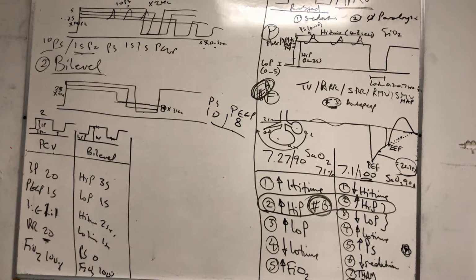Nobody's complaining about it. When we started doing 2 SBTs a day, what happened is that now the respiratory therapist is in CAT scan, for example. So the nurse turns off the sedation and then calls for the respiratory therapist. He comes in 15, 20 minutes later, half an hour, 1 hour later to switch the patient to pressure support, and we started seeing problems. The nurse is saying the patient is not even tolerating the SAT. Not the SBT. We didn't even put him on the SBT yet. Just the wake up. We just turned off the sedation, and the patient is already breathing in the 50s, right? And why is he doing that?